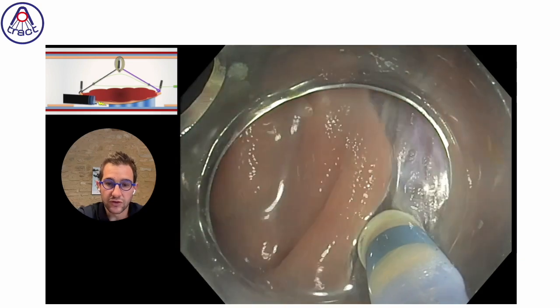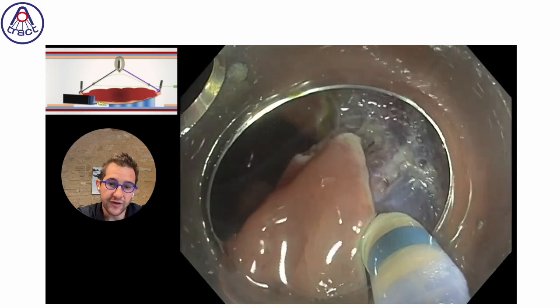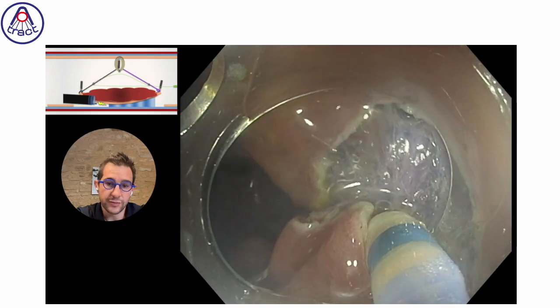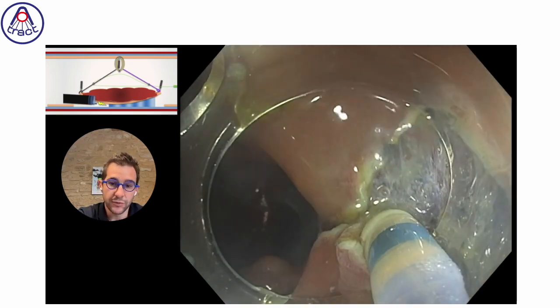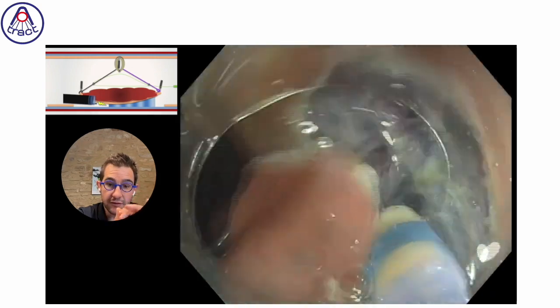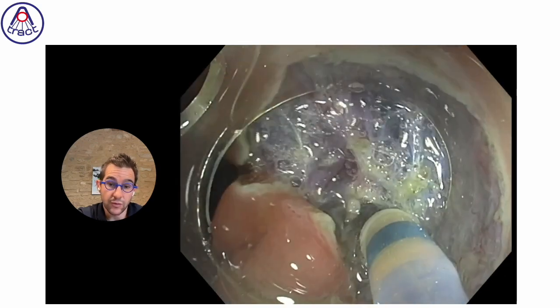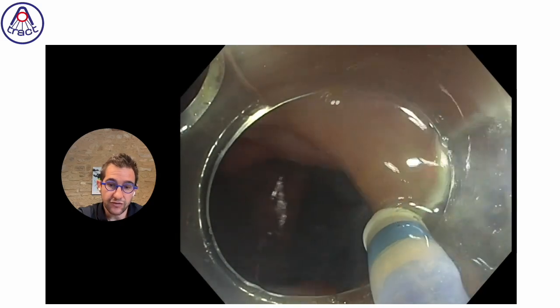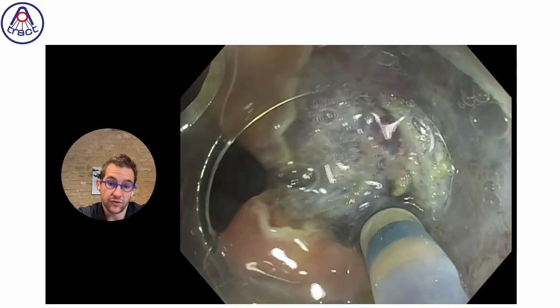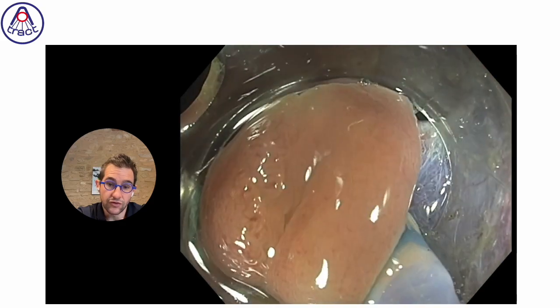She tried to go to the opposite side, and you just make her free, cutting the submucosal fiber. So really, it's not the same game now. But before, you should be able to do a proper incision, a proper trimming, a proper traction device placement and setup. And all these things need a lot of experience with model training, with supervision to be able to set it up. But once it is placed, you can see that the game becomes easier and usually goes faster.